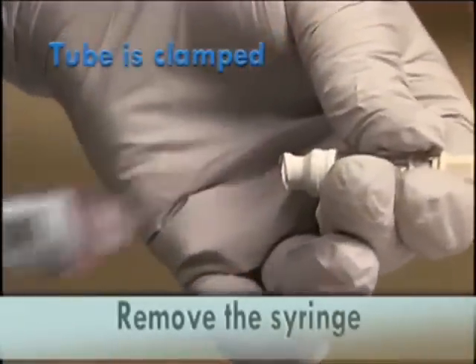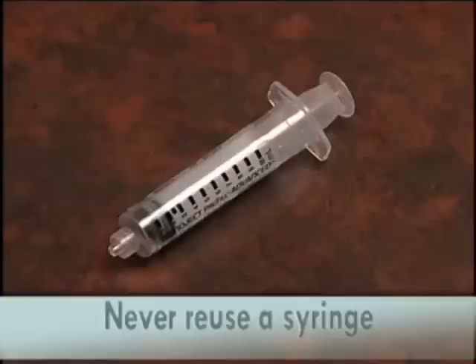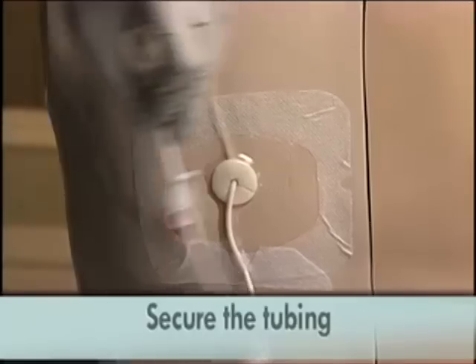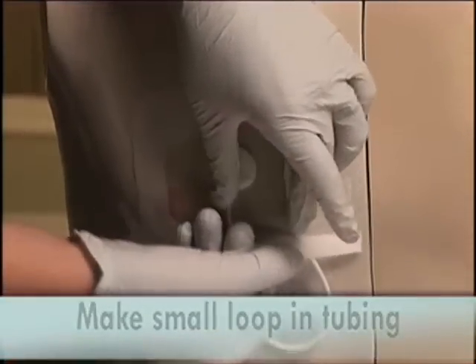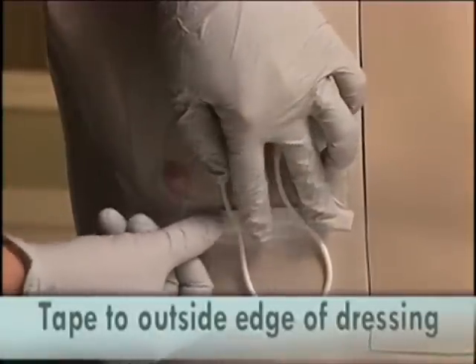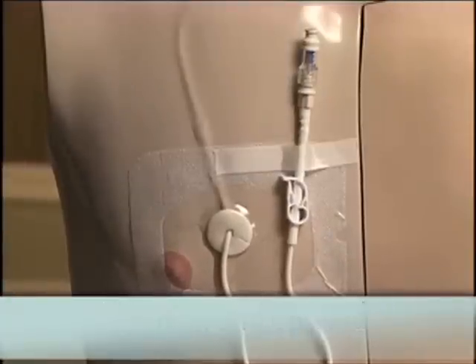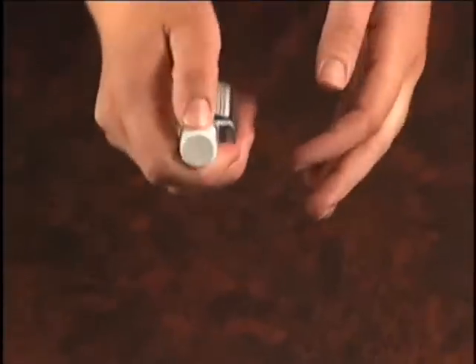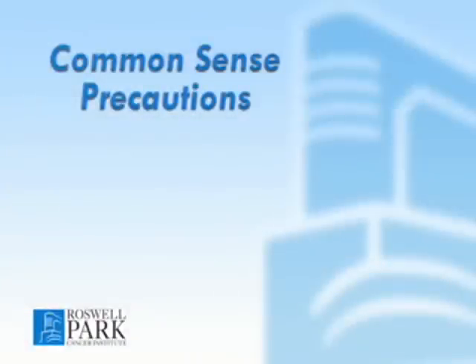Remove the syringe. Dispose of the syringe properly — never reuse a syringe. Affix the tubing to your skin. Make a U-loop with the catheter and tape it securely to the outside of your dressing with the end cap facing upwards. This will secure the tubing to help prevent excess tension on the tube and reduce the risk of dislodgement. Wash your hands.